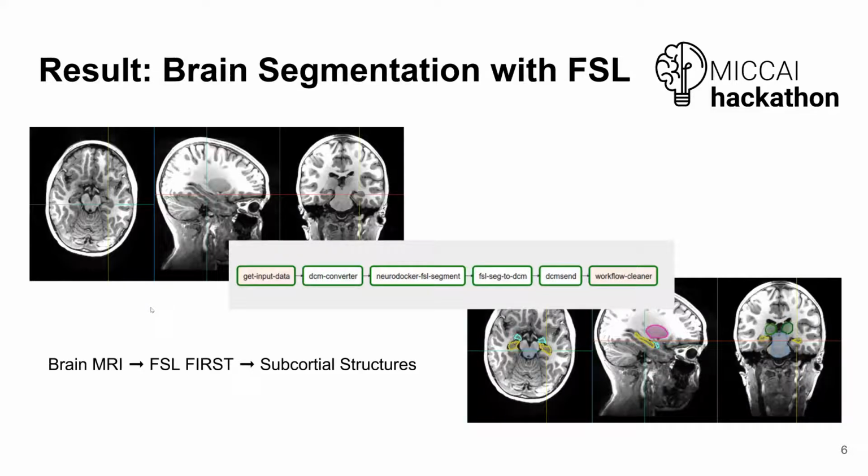All right, then the next task was also a segmentation task, but this time on brain MRI. And for this, we integrated the FSL toolbox for segmenting neuroimages. So similar to the task before, we had basically this DICOM to NIfTI converter in the beginning.